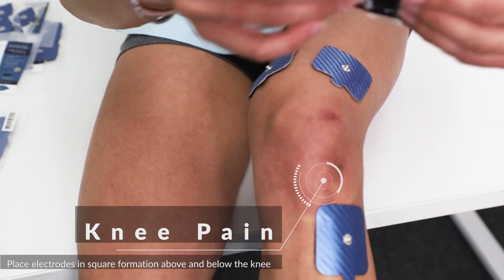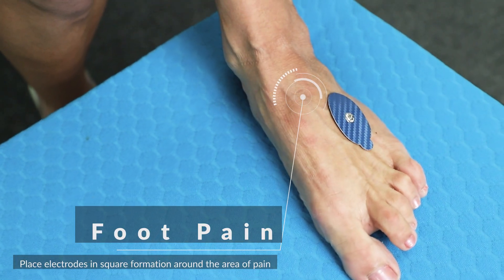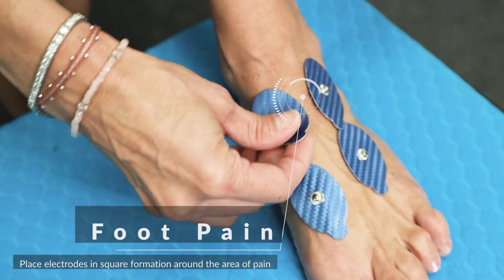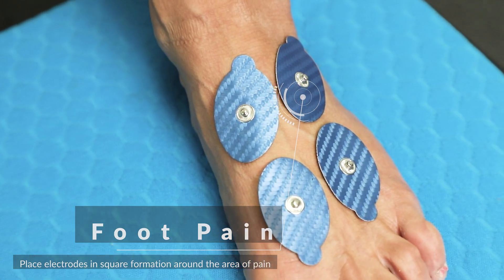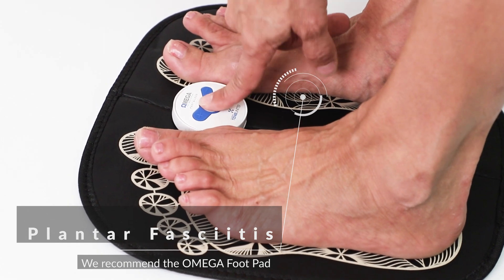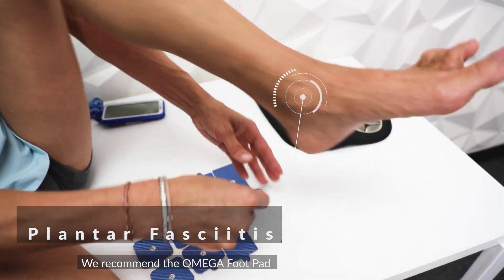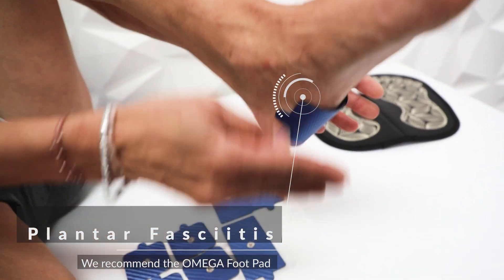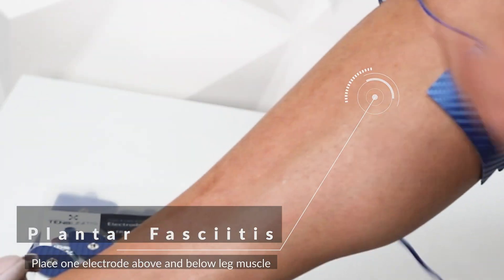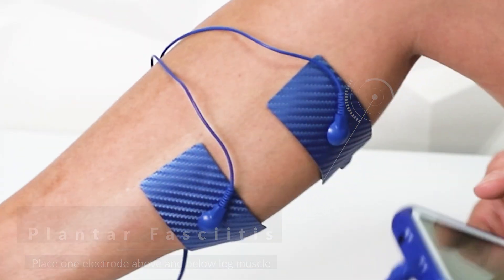One above and one below your knee on either side. For any foot pain, place the electrodes in a square formation around the area of pain. Be sure to evenly spread the placement of each electrode. For plantar fasciitis, we recommend the Omega foot pad. If you would like to use square electrodes, place one electrode on the heel of your foot and one right under your ankle bone. Continue up the leg and place the other two electrodes on your leg — one above your leg muscle and one under it.